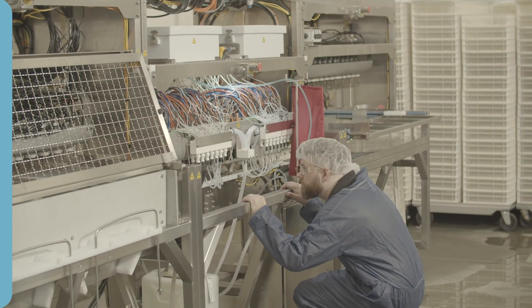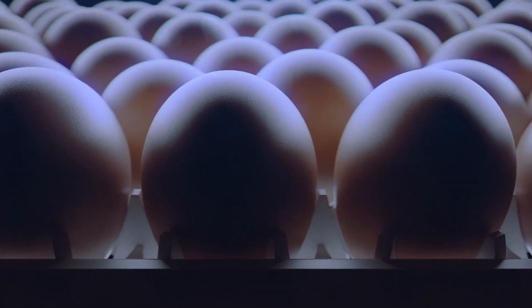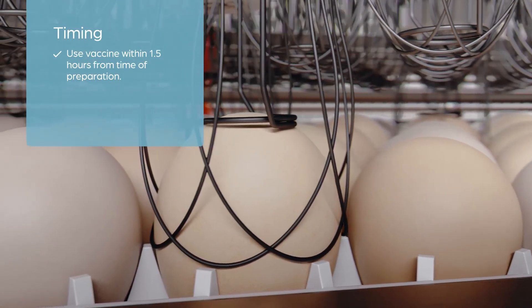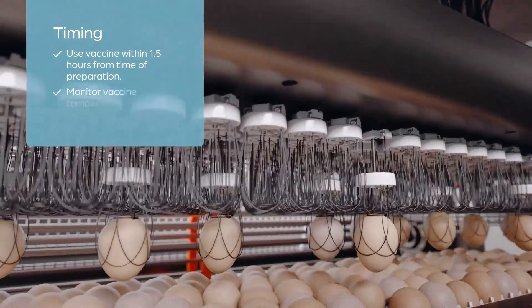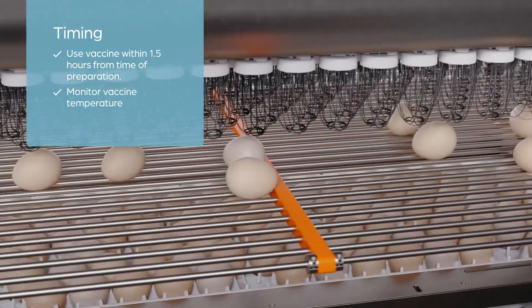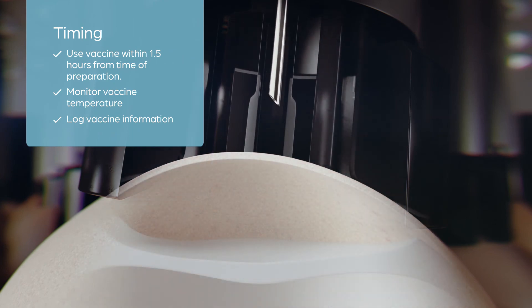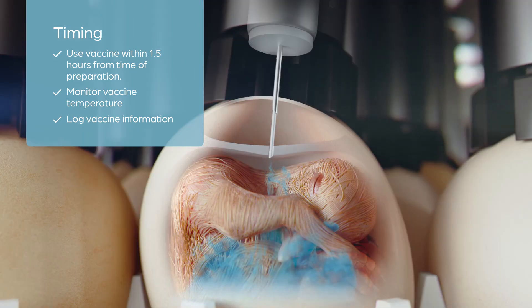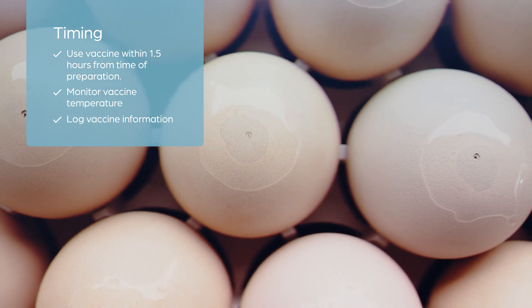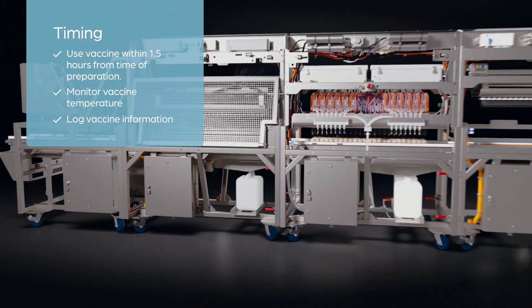Return the transport cooler to the lab. Prepared vaccine must be used within one and a half hours from the time of preparation. Recommendations may differ according to vaccine type and manufacturer. During Innovoject vaccination, vaccine temperature will be between 35 degrees Fahrenheit and 50 degrees Fahrenheit. Finally, keep a daily log of vaccine types, numbers, lot numbers, expiration dates, bag size, vaccine amounts, and other additives used per bag. Zoetis stands ready to train your team on proper vaccination protocols in the hatchery. To find even more ways to improve your team's vaccination performance, contact your Zoetis representative.